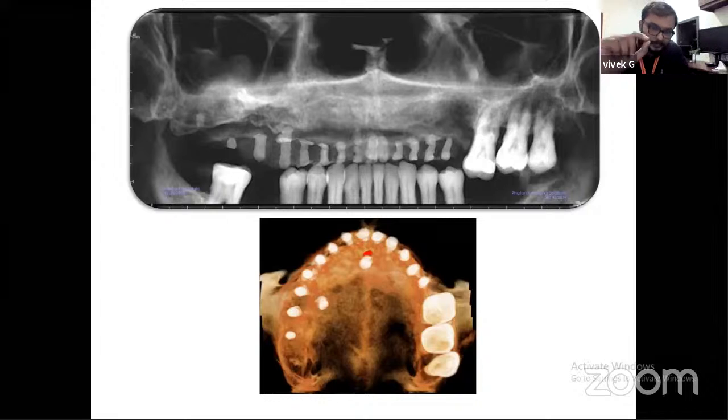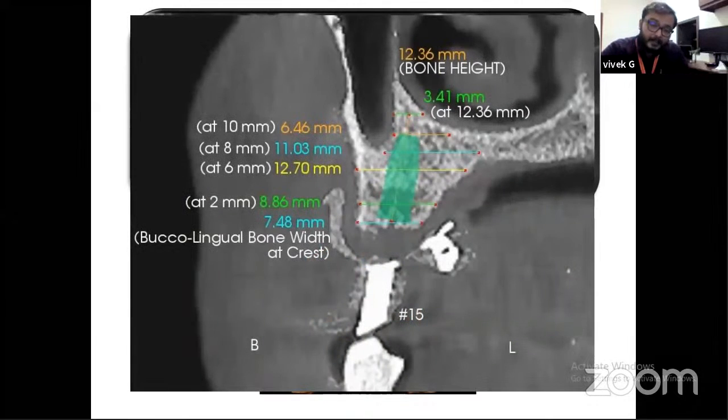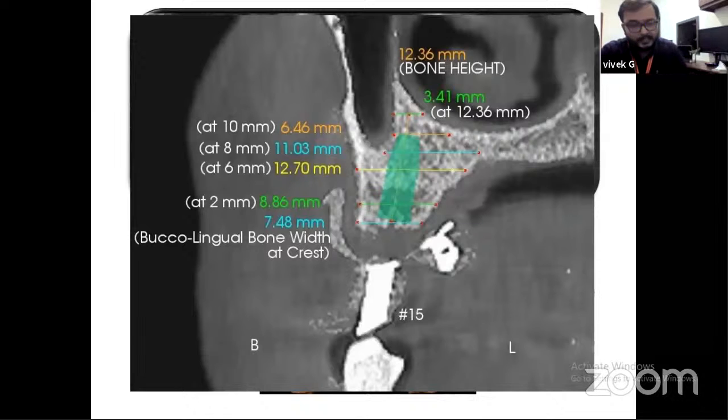Here you can see that those thick radio-opaque markers are nothing but gutta-percha, which has been drilled into a shellac base plate, which was given as a cast. And you could see those bullets in three-dimensional radiography also, and with the help of those radiographic markers, we could easily identify the place where your implants need to be planned.